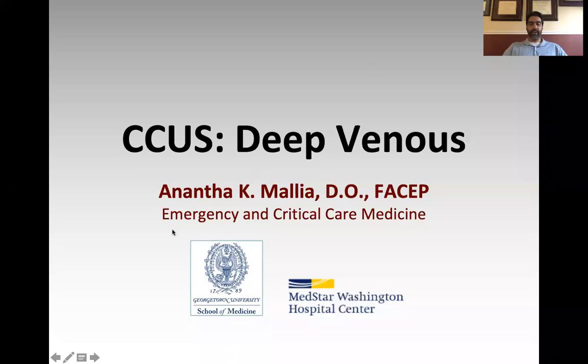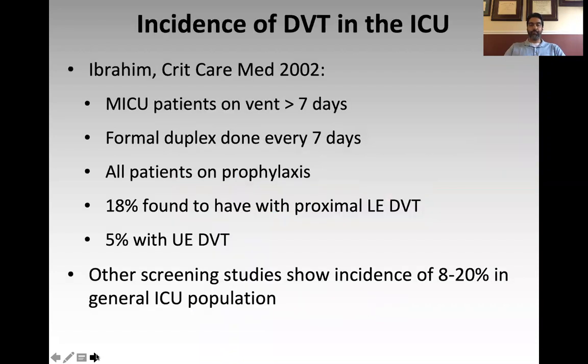Deep venous ultrasonography to diagnose DVT. Not the most exciting modality in point-of-care ultrasound, but as I hope to demonstrate, there are a few specific scenarios where knowing how to diagnose a DVT acutely, I think will serve you well.